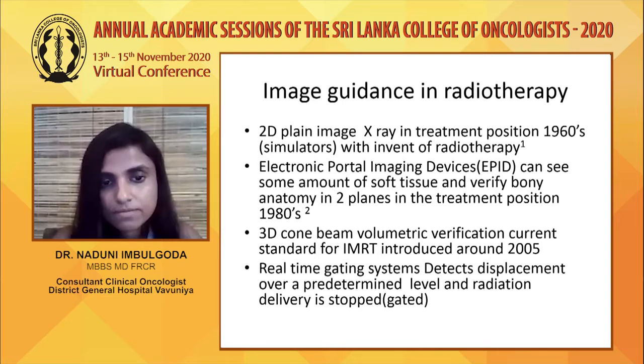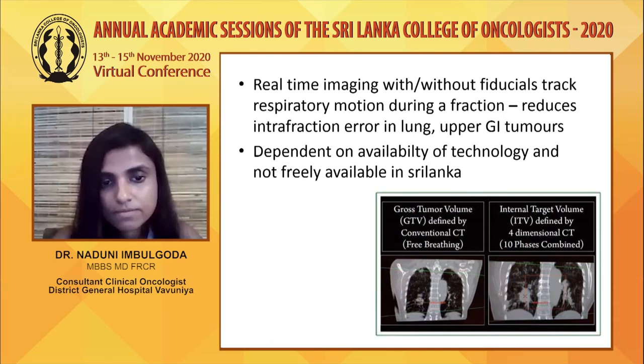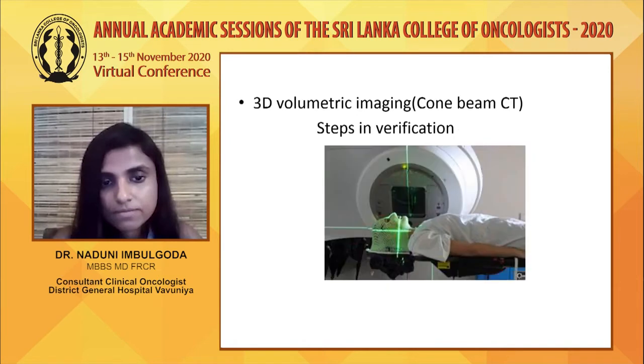And we also have real-time gating systems that detect displacement over a predetermined level, and radiation delivery is stopped, or gated, when it goes above the threshold. So real-time imaging, with or without fiducials, tracks respiratory motion during a fraction. It reduces intra-fraction error in lung and upper GI tumors. This is dependent on availability of technology and is not freely available in Sri Lanka. So in my talk, I will concentrate mainly on 3D volumetric imaging, that is the cone beam CT.